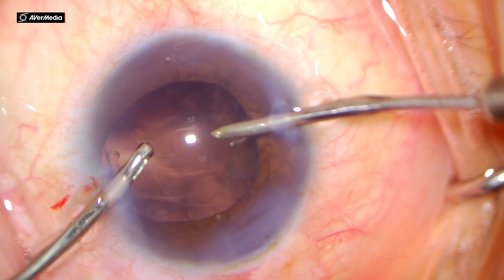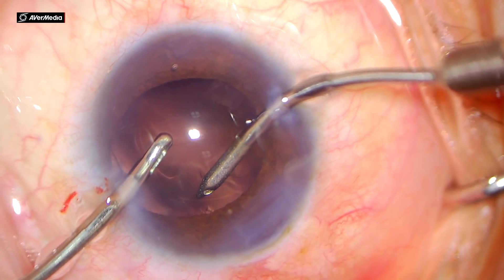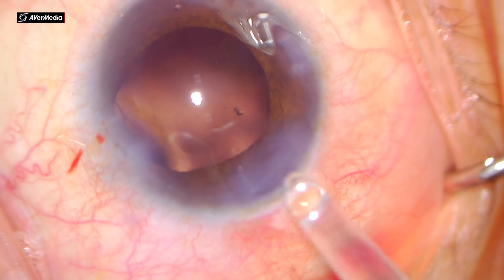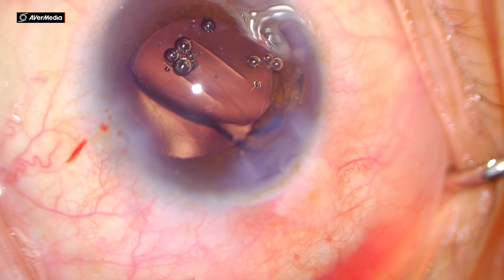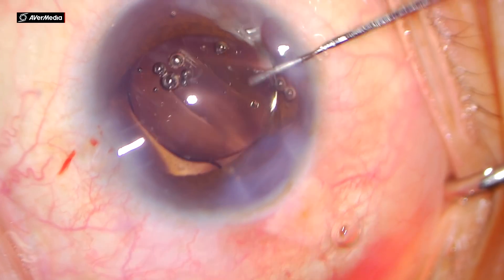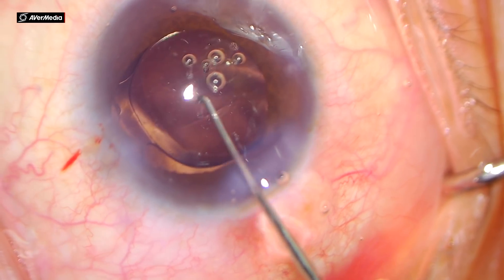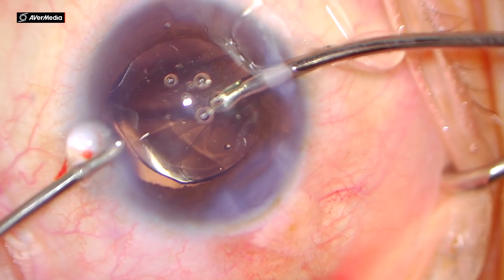There was some cortex left so I did cortical aspiration. Till this point I was not aware of any vitreous disturbance — the bag was inflated and the cortex was coming out very easily. After completing the cortical cleanup I injected visco again, then implanted the intraocular lens in the bag. My intention was to deposit the haptics in the direction of the dialysis, which would support the dialysis portion more along with the CTR itself. The IOL went nicely into the bag, and then I continued with irrigation and aspiration to remove visco from the anterior chamber.